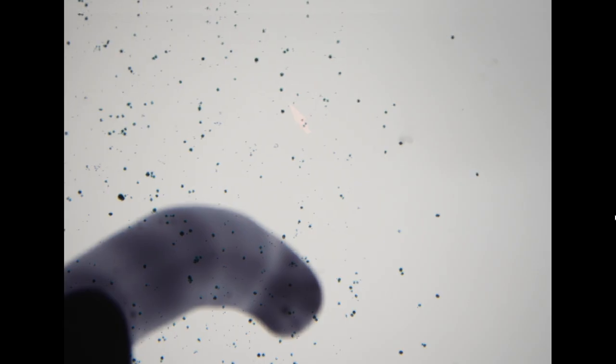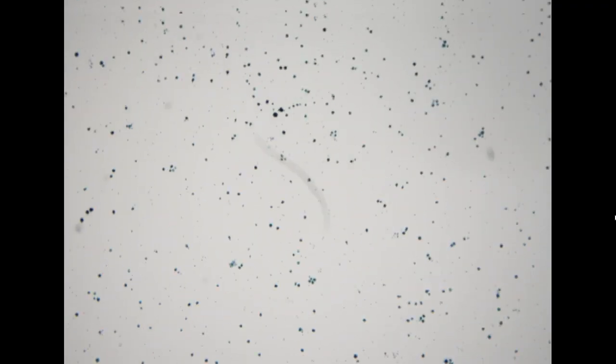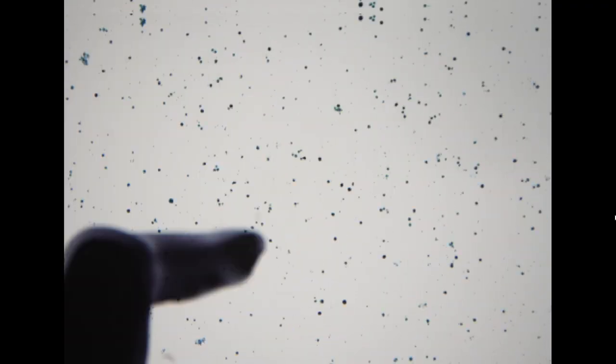So the next specimen is coming from a neck lymph node. In this specimen, first of all, we do not see lymphoid tissue, lymphoid cells in the background, but we do see a lot of histiocytes. So this is actually a cystic background. Whenever you encounter a lymph node aspiration with a very cystic background, it is abnormal. It is not normal. In the head and neck, the most common scenario is a cystic metastasis, and the most common origin is papillary thyroid carcinoma.